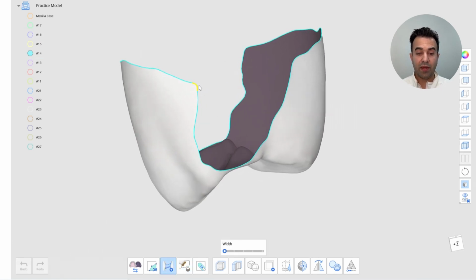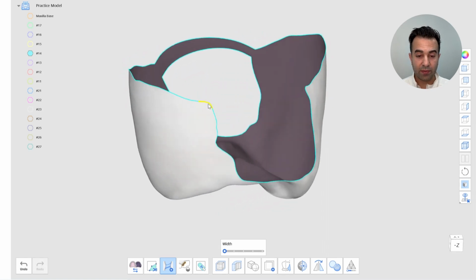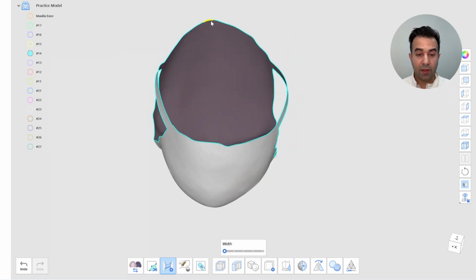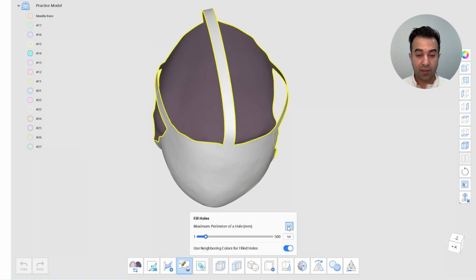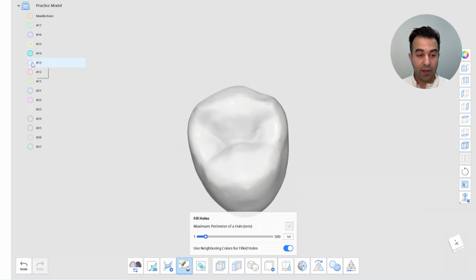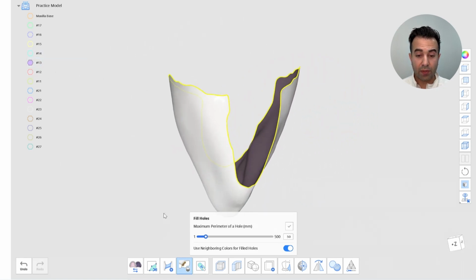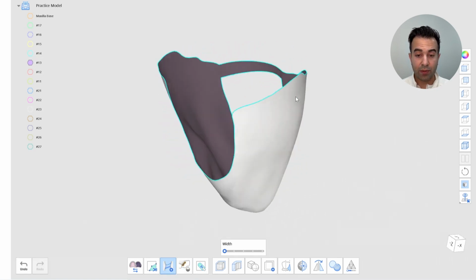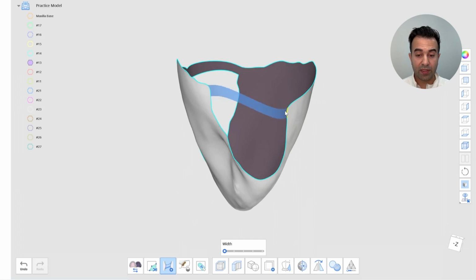Make it invisible, make the adjacent tooth visible. And we are going to repeat the same process 14 times. However, the time that you'll spend on this process is an investment because you do it only once, and then you'll be able to save these 3D teeth in your MeditLink or even on your local PC. And I'll show you how I'll be able to use them for future projects by simply drag and drop or click the import button in the Medit Design app.